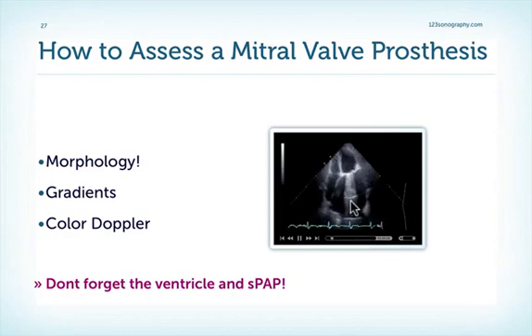the heart chambers. Here's a beautiful example of a patient who has a very, very large atrium. This is also very important information as to the function of the valve and also to other cofactors which may play a role in the management of these patients.